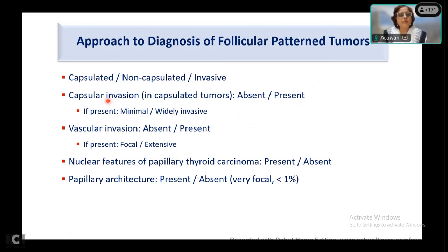Okay. So there are some synoptic-like reporting points that you can at times use. These are just pointers towards what things you should be looking at, so that you don't miss any of them, and based on the findings you can divide into other categories.